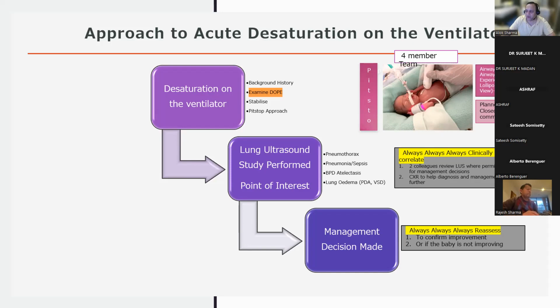Always, always, if you decide that you've got lung atelectasis, basal zones at the back, you're going to increase the pressure, you want to recruit lung, really what you need to do is go back in half an hour and check and make sure that that's improved.